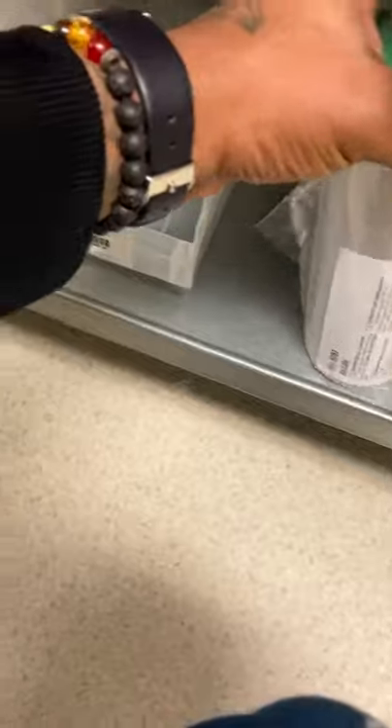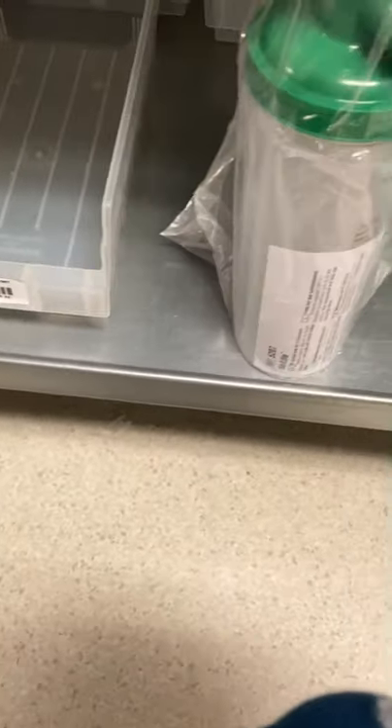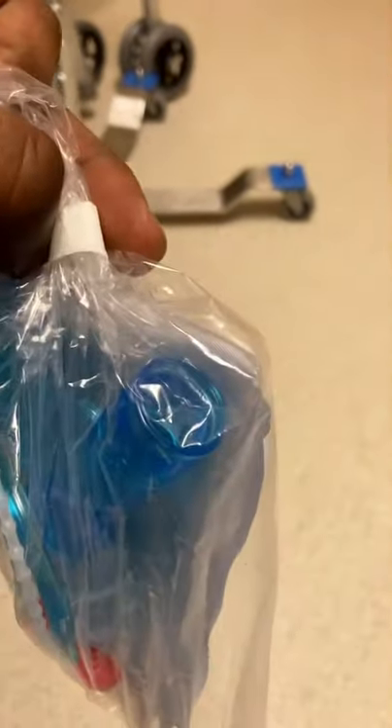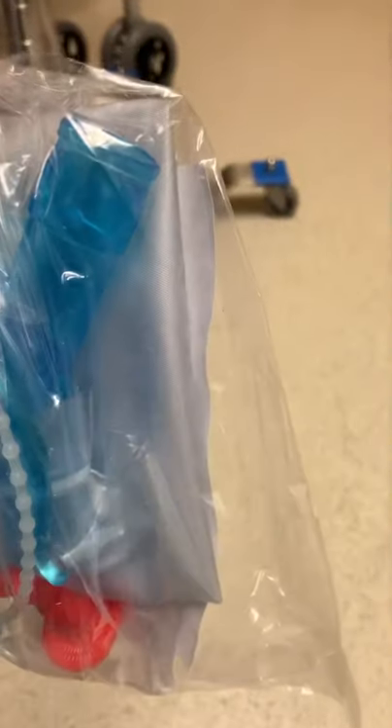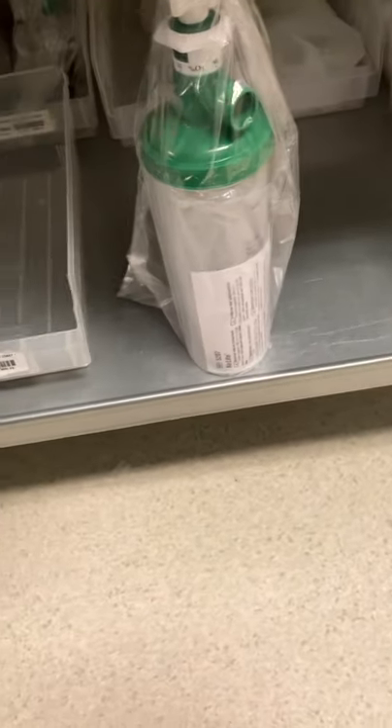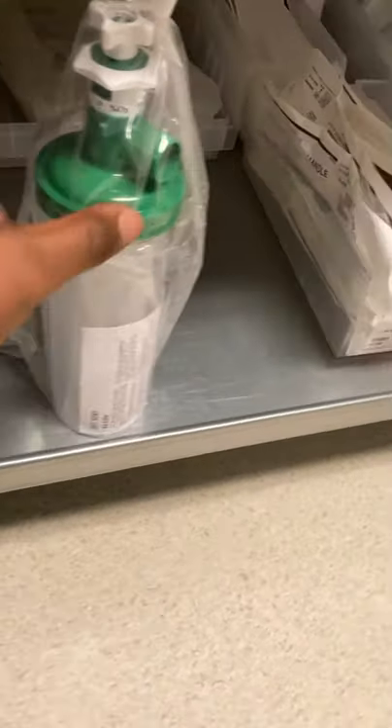The corrugated tubing connects to a drainage bag. Here we go — this is the drainage bag. As you can see, the corrugated tubing goes in here. Excess humidity — the water from humidification — drains into the drainage bag. You'll then connect it to an aerosol mask or a trach mask.